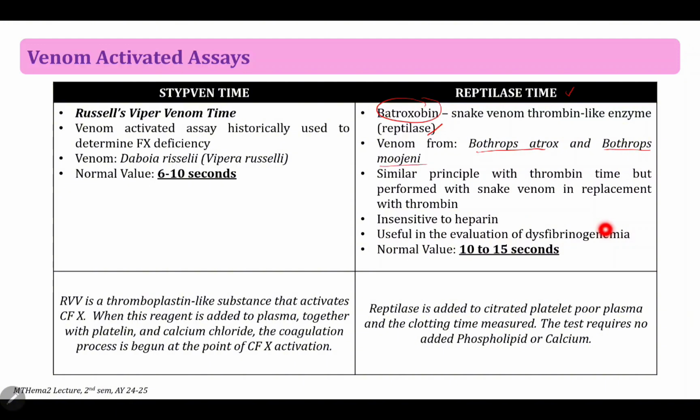Okay? Now, similar lang din with thrombin time and Stypven time, si reptilase time. You have the patient's plasma and then you add it with your reagent. In this case, ang reagent natin ay si reptilase. And then, after nun, i-check mo yung presence ng clot.